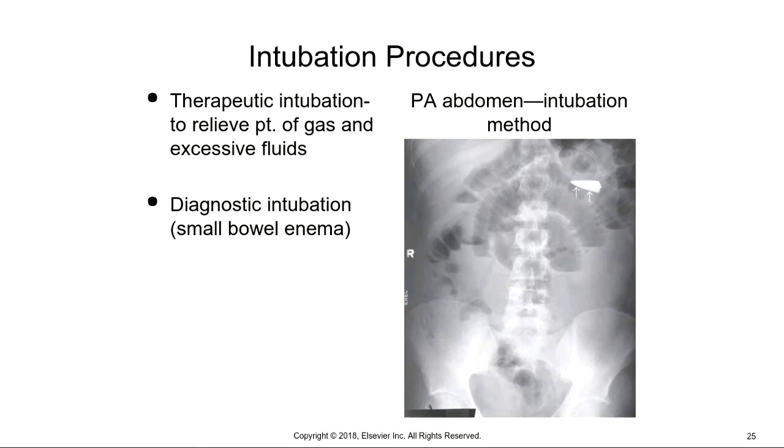All right, the intubation procedures. These are on page 499. And as far as the intubation, there's two different methods. You have a diagnostic method or a therapeutic method. So the intubation can either be a diagnostic intubation or a therapeutic intubation. Now, if it's a therapeutic intubation, remember therapy is done to improve the function of something. So when it's therapeutic, we're not trying to diagnose anything.